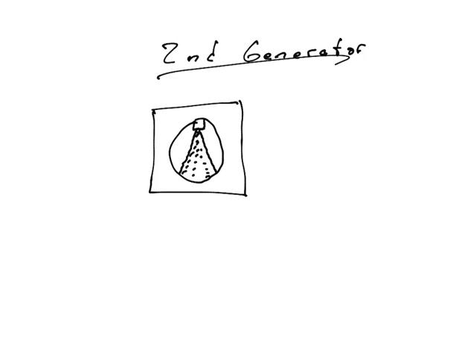And you have some set of detectors. Instead of just one single detector, you may have 4 or 5 detectors around here. And of course the same thing happens, right? You rotate around and translate, slide back and forth just like before. But now, since you have this fan beam configuration of X-rays, you get a bigger piece of the slice with each pass, instead of having a single little line that cuts through the object.